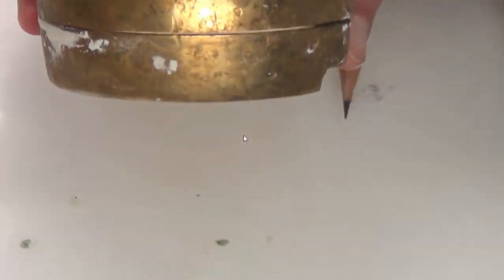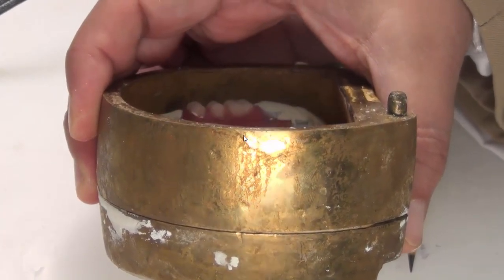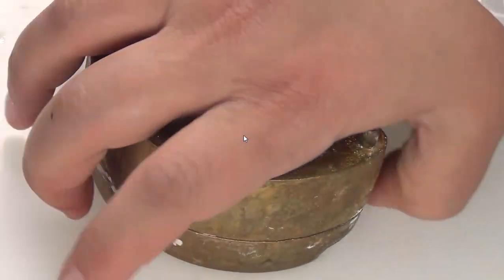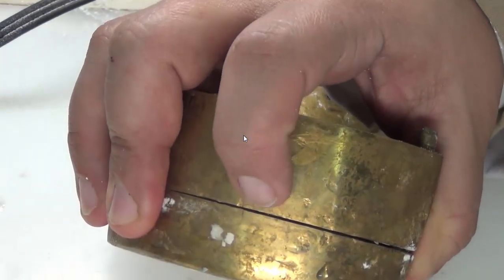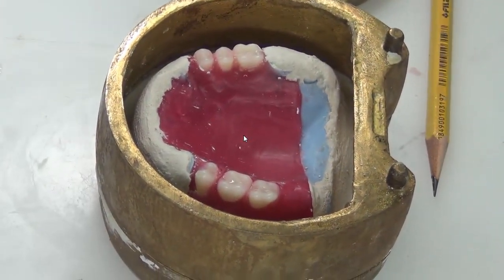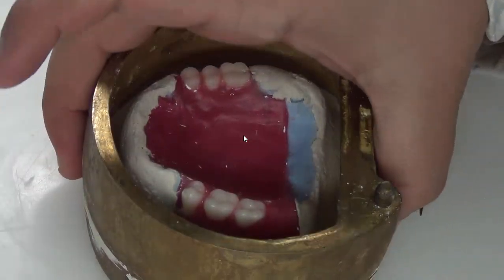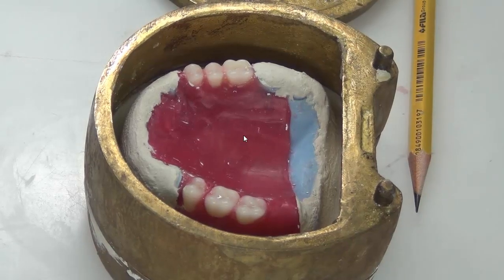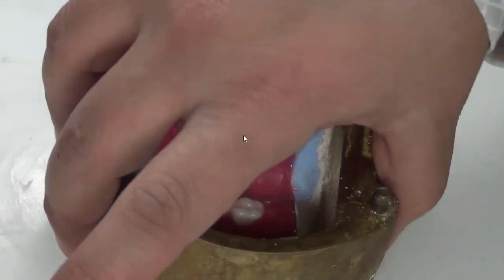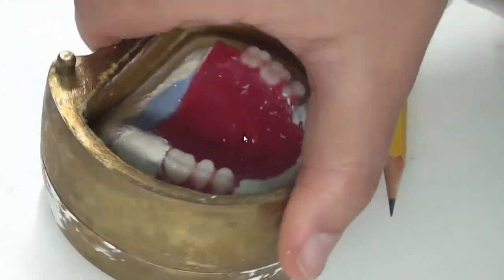Notice that because we have removed all plaster from the sides, we have good metal-to-metal contact, okay? Why do we need this metal-to-metal contact? Because at one stage, we're going to pack acrylic under force, using the press. If we have plaster, it will fracture off, okay? If we fracture this off, the dimensions of the denture thickness will be changed. So we don't want the thickness of the denture to change or the location of the teeth to move in relation to the ridge. Although it's 1 millimeter here, that means 1 millimeter high inside the patient's mouth. The teeth are higher or lower by 1 millimeter, and this will cause problems, okay? So we have to make sure to maintain the dimensions of the denture as we have planned, with metal-to-metal contact all around the flask at all sides, okay?